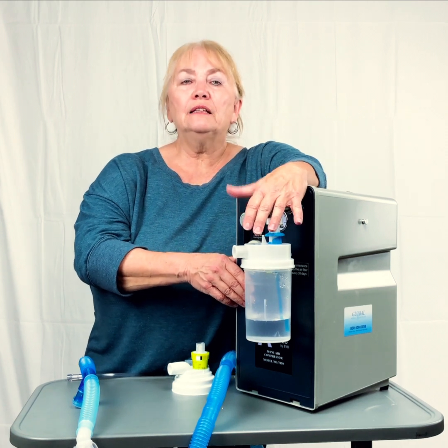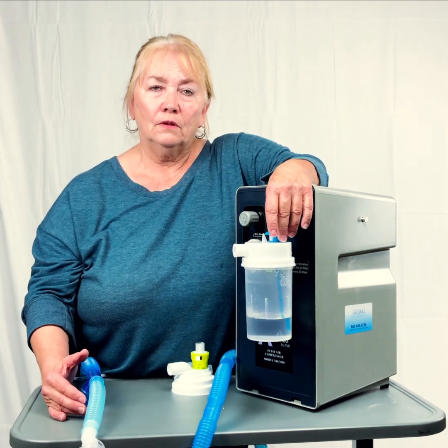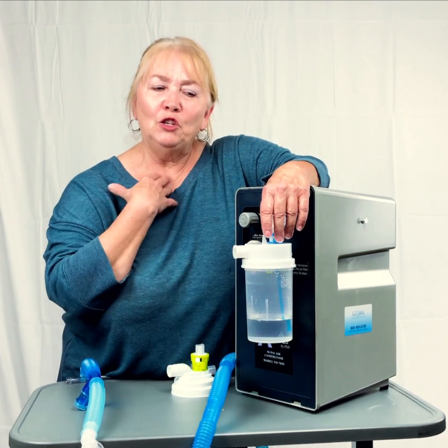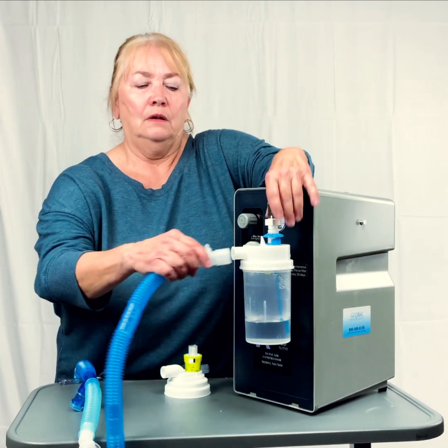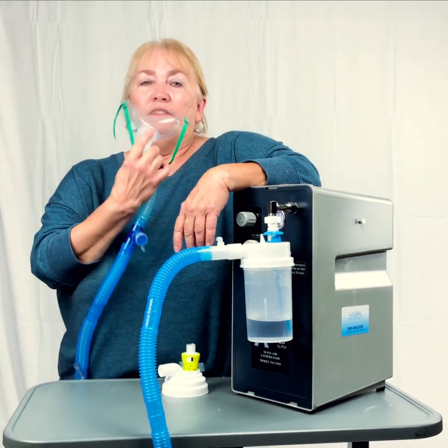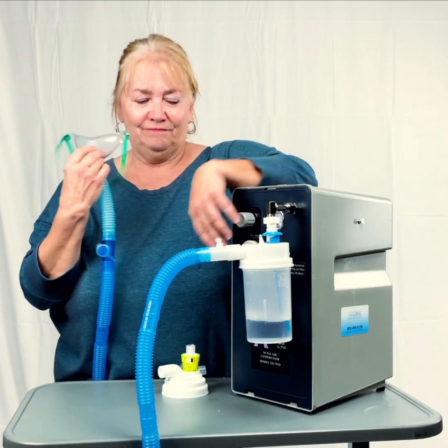If you feel that you're getting too much mist, please contact your nurse or contact respiratory so that we can figure out exactly what's going on. But again, you want sufficient mist so when they inhale, you have extra mist. And again, this would not be at their face, this would be around their neck. Thank you.